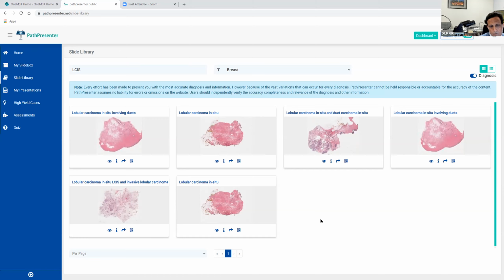So the older literature, of course, may not have any term such as pleomorphic LCIS, because they only recognized one type of LCIS. Of course, there were astute pathologists. It is not that E-cadherin alone brought about this terminology.